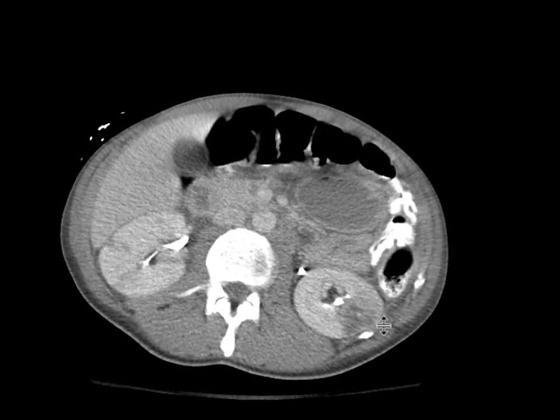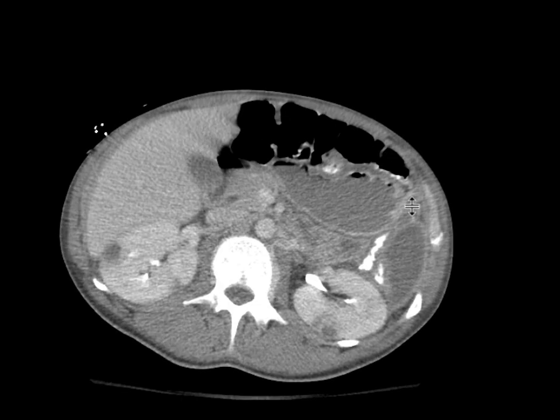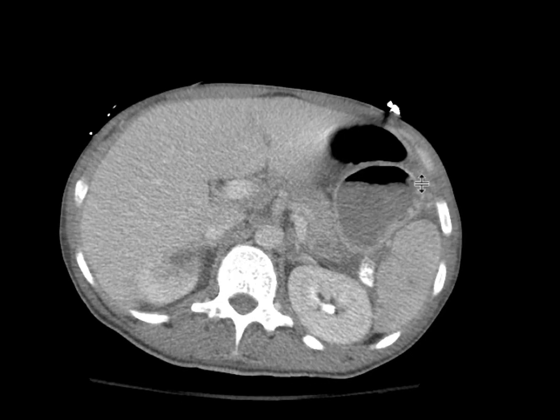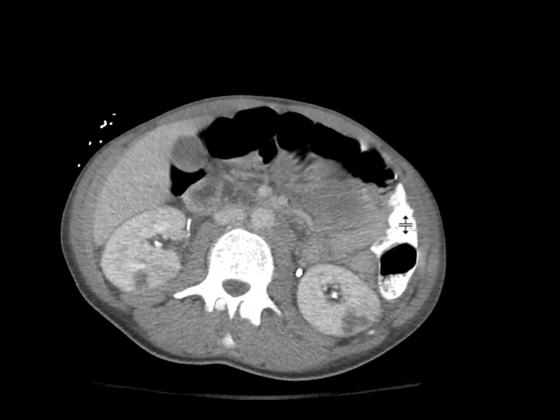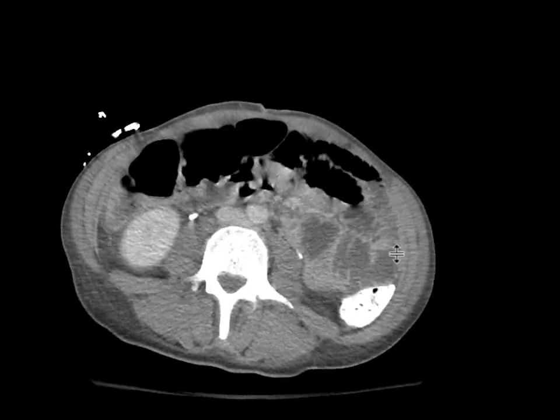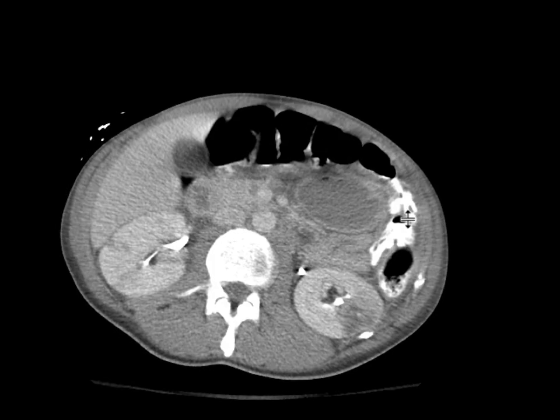If you look at this lesion over here, for example this infarct, we can see a rim of preserved perfusion along the renal capsule, and that's known as the capsular rim sign that we can see with renal infarcts.